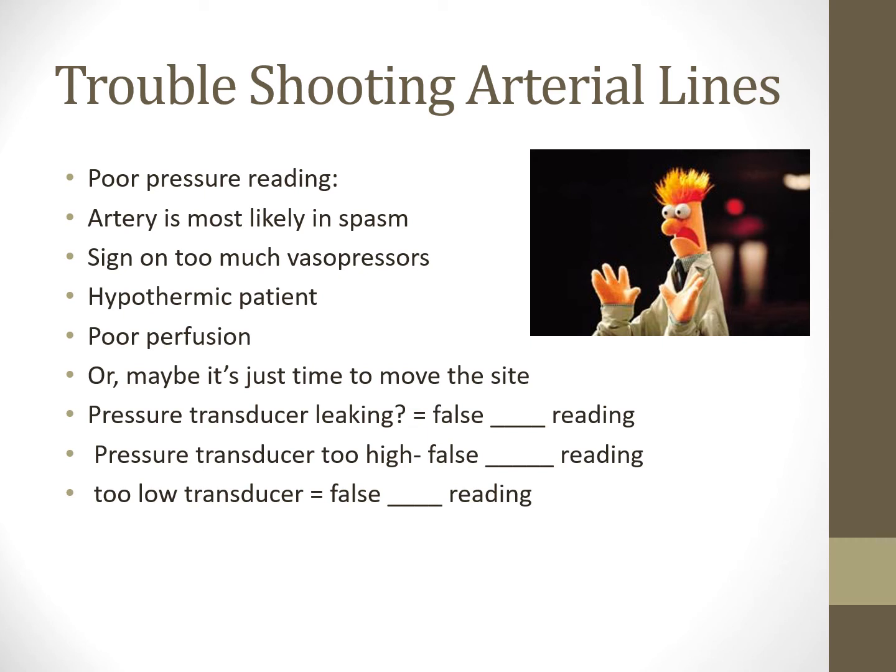We usually have to move them if we still think they need pressure monitoring. Then we'll have to move the site from the right radial to the left or vice versa. So that's something that we'll have to look at risk versus benefits, right?